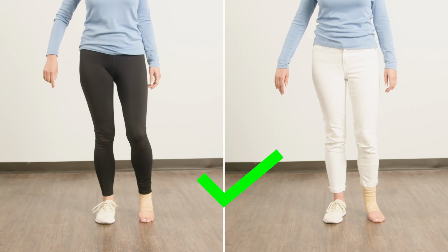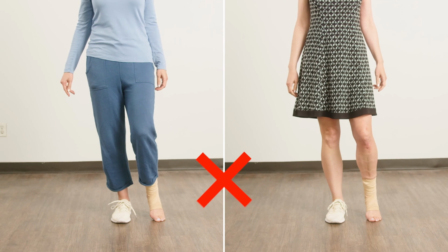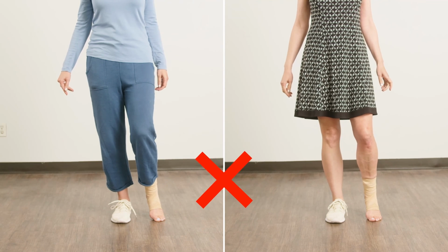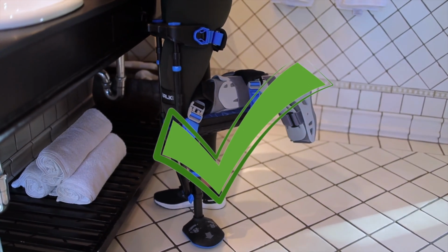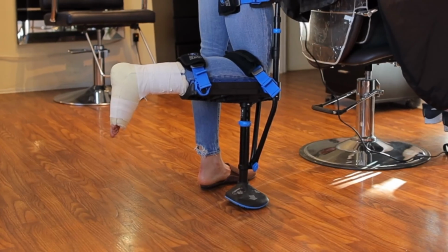Prepping the patient. The patient should wear form-fitting pants that allow you to easily identify where the top of their leg is. Avoid baggy pants, shorts, or skirts. Empty their pockets of any belongings. Patients should wear comfortable athletic shoes or be barefoot. Avoid sandals, open-heeled shoes, or heels.